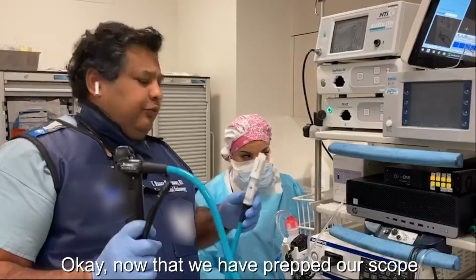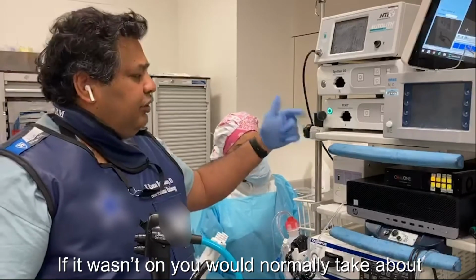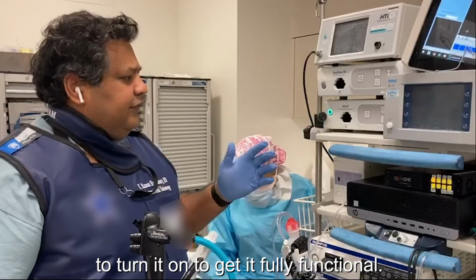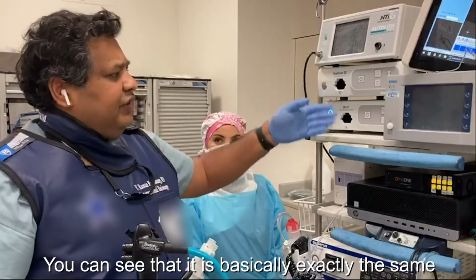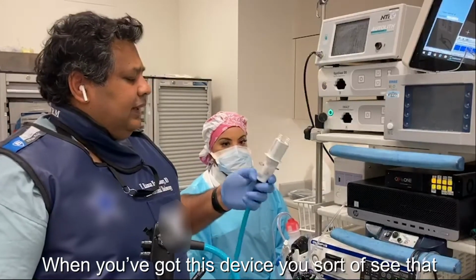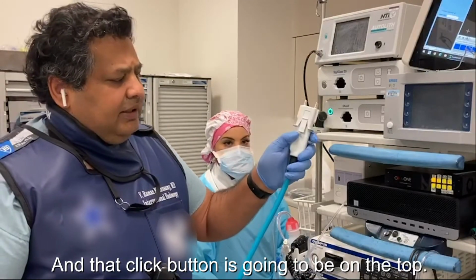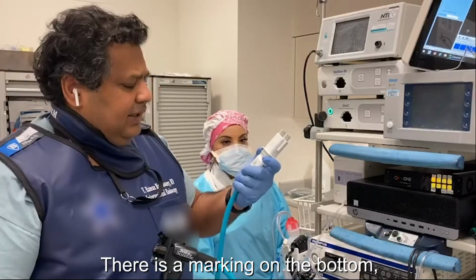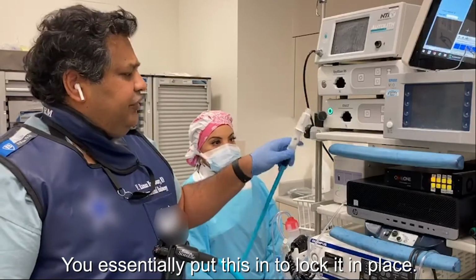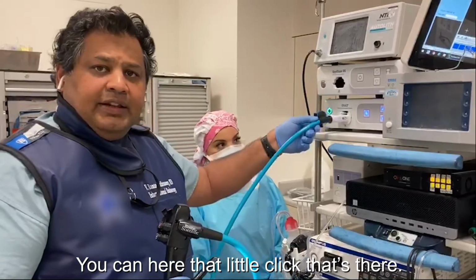Okay, so now that we've prepped our scope, we have a controller box here. It's already been turned on. If it wasn't on, you'd normally take about 15 to 30 seconds. You'd press this button and turn it on to get it fully functional. You can see that it's basically exactly the same as a spyglass box, which actually sits on top of it, but it is separate. When you've got this device, you see that there's a click button here, and that click button is going to be on the top. There's a little bit of a marking here on the bottom. That's the part that goes on the bottom. So you essentially put this in to lock it in place. You can hear that little click that's there.